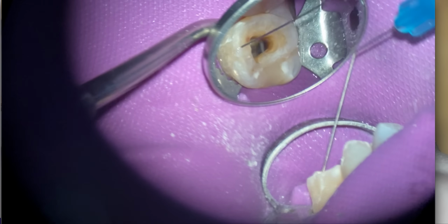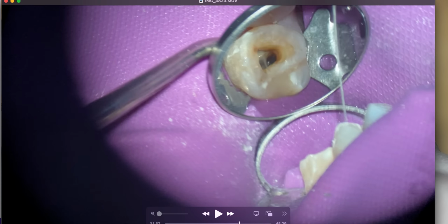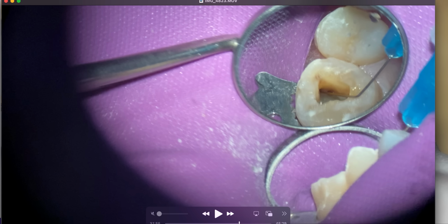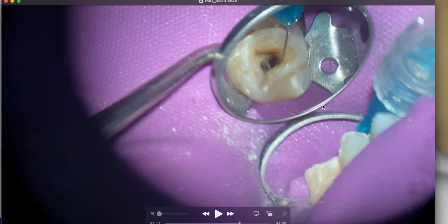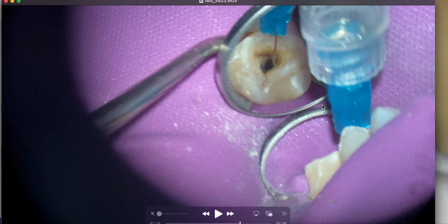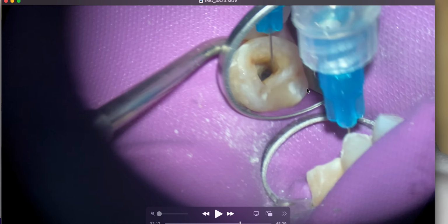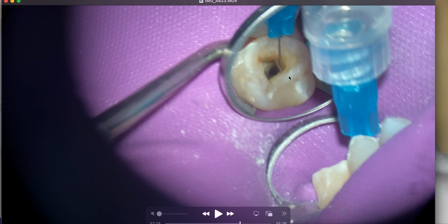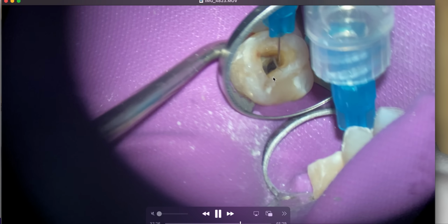And the reason why I'm doing this is because I find it's a really safe way of irrigating those large canals. So there's MB1, MB2, there's our distal buccal. I'm sorry, it's out of focus just a little bit. And then, you can't see because the beam splitter only shows one bino, but way down I could see a little bit of calcium hydroxide. You can kind of see it's white at the bottom, right there.